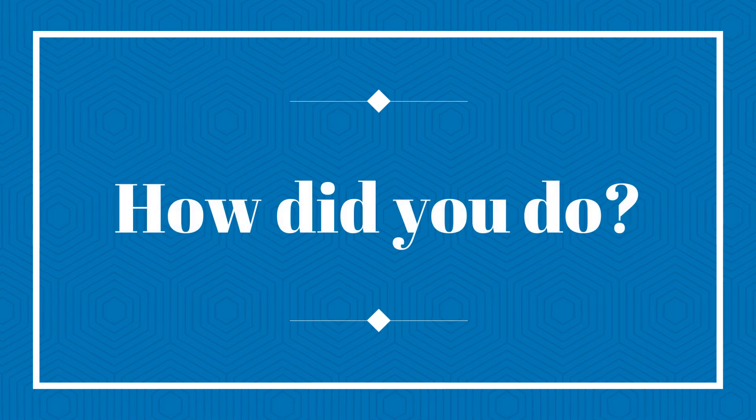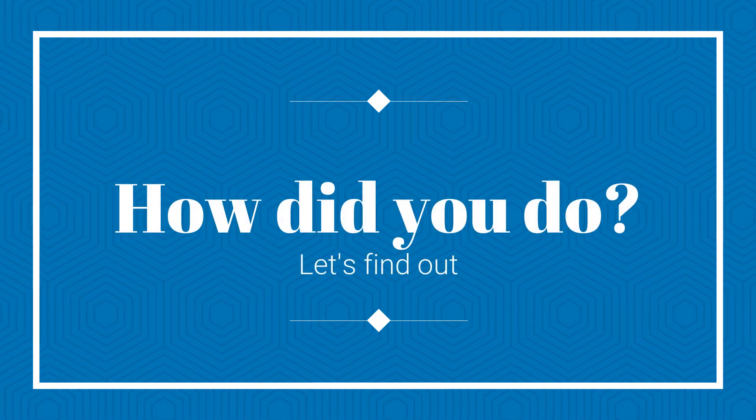How well did you do? Let's find out. Let's watch the video again and we'll pause and point out all of the errors.